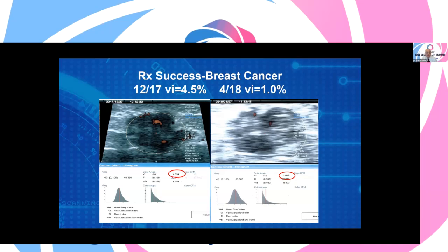Plus, since the imaging is virtually immediate, you tell people what's going on. This is what's happening now. So the treatment is working or not working. People want to know, where am I now? And not guessing, and certainly waiting, as the last lecture explained, if anxiety is not good for cancer healing. Next, please.